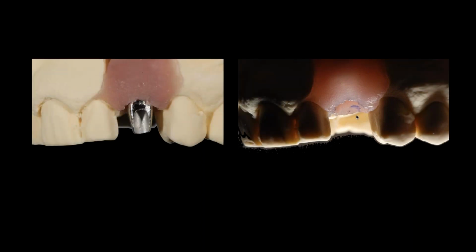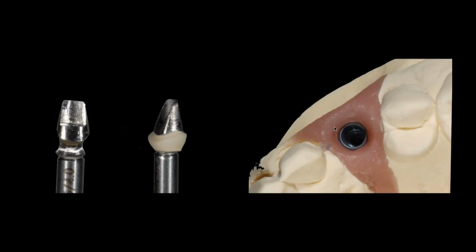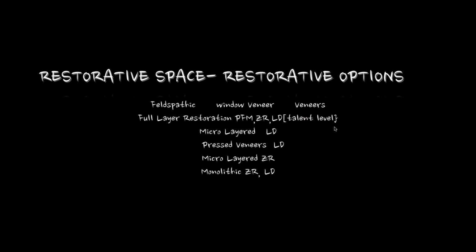What did I do here? I made a tissue cast. I took my camera and my flash, moved the flash behind the tissue, and took a photograph of it. Now I can actually see the light going through the tissue and really start to figure out how much tissue I have there. That might change if I want to do a metal abutment or maybe make a ceramic abutment to help manage the coloration of the tissues, right? So you see how all that starts to play in together as I'm working my way through the restorative process.